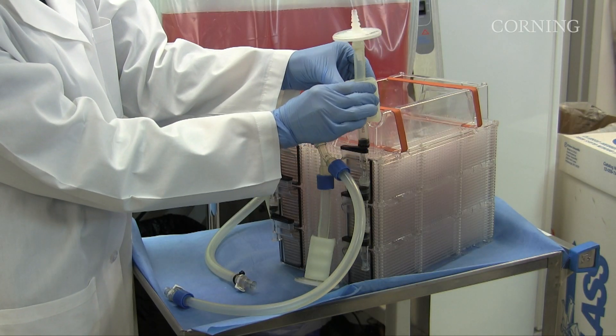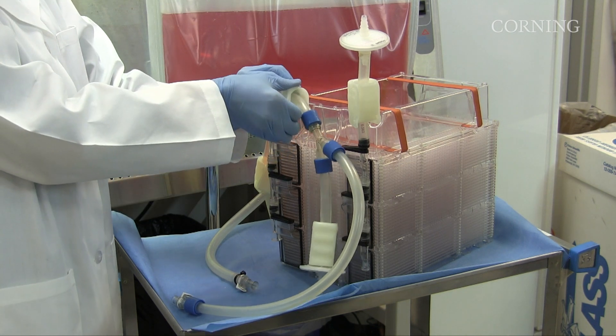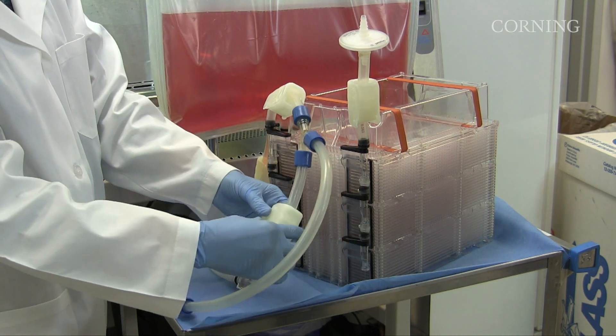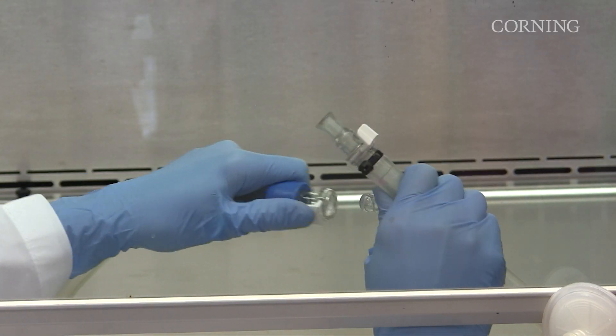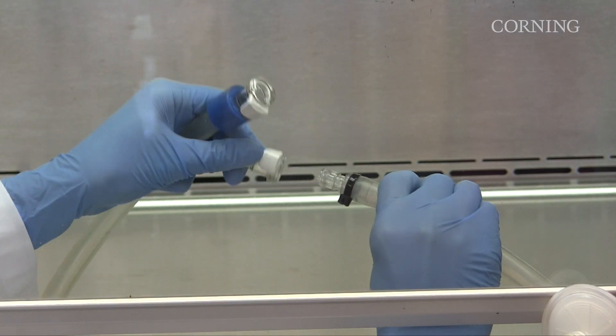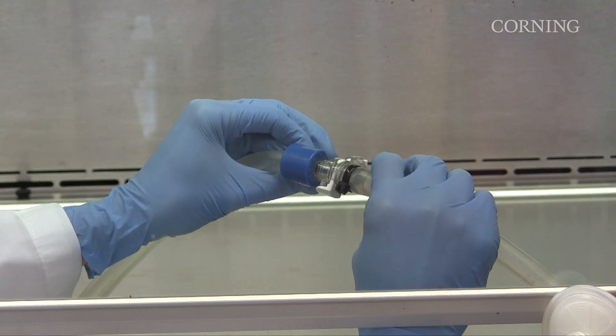Before filling the vessel, close all clamps on the Hyperstack vessel and the source vessel containing cells and media. Connect the source vessel to the Hyperstack vessel in a biological safety hood using the MPC quick connect on the liquid handling tubing or tube weld.